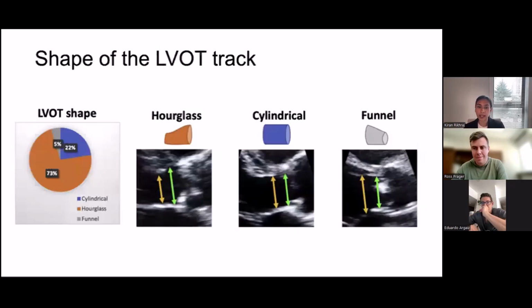The second is refining your technique. And this is something that I find when you're starting out, and I know for myself, when I was starting out, I tried to rush it, right? I was like, that's good enough of an envelope. I'm going to take that. I'm going to trace it. Oh yeah, so what if I have my aortic valve opening? And it's tempting to do that, but you're doing yourself a disservice, you're doing your patients a disservice. So really work on refining the technique.